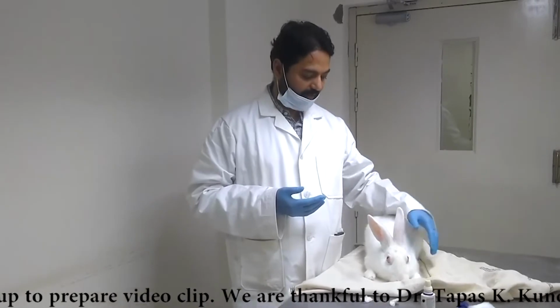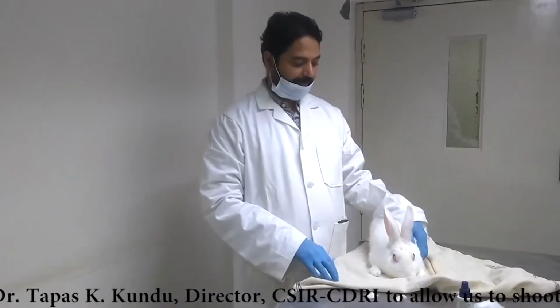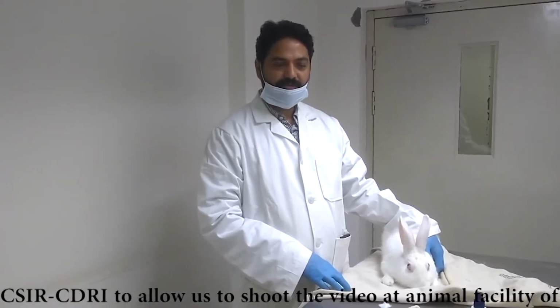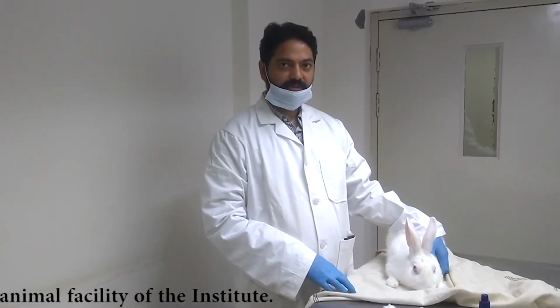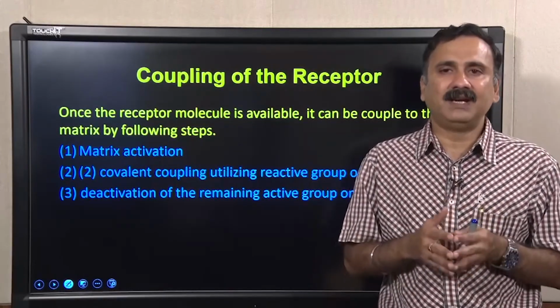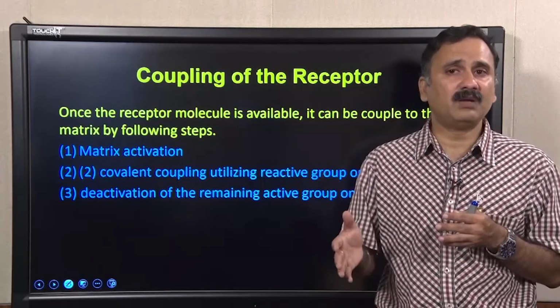It should be relaxed. So in the whole of the process, I think you have got to know all the steps of antibody development in rabbit: we prepared the immunogen, we injected the immunogen, we isolated the blood after giving sufficient booster doses, and the whole process is involved. I think you have understood most of these processes, and you liked it. So this demo video will probably be very helpful for you to understand each and every aspect, especially the practical aspect related to antibody production.